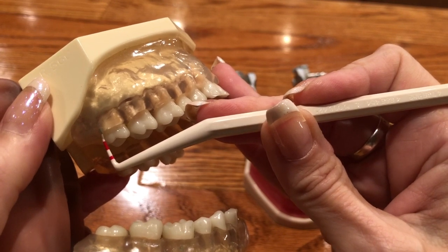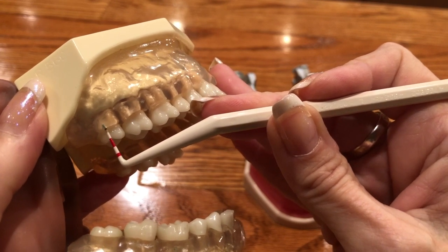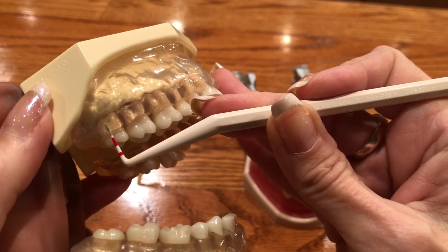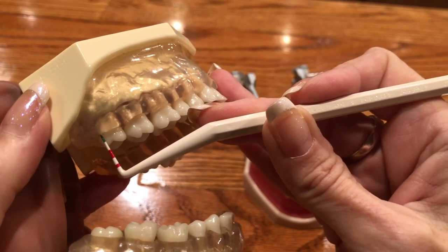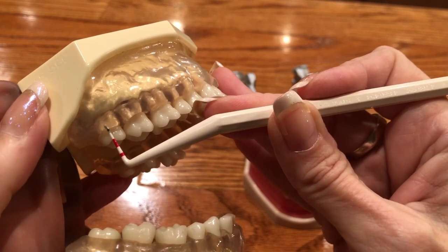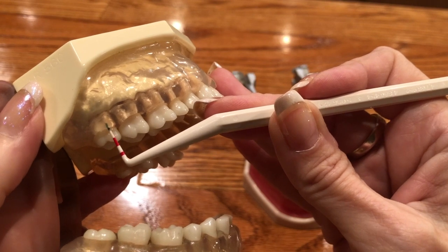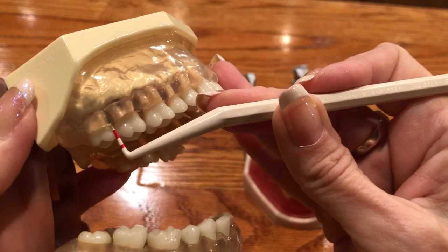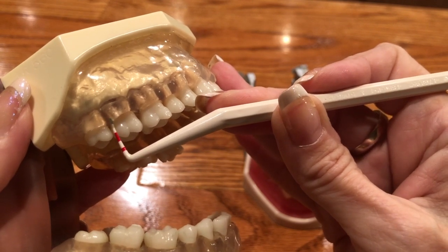So you can see this is a 3. And then she'll kind of walk it across and measure points on the tooth. And it could fall down below here or when we walk in. Generally, we measure the distal, the straight, and the mesial like I just said. So if she walks it in, this is a 3, still going over to 3, coming back over, this would be a 4, and then moving to the next point of the tooth.